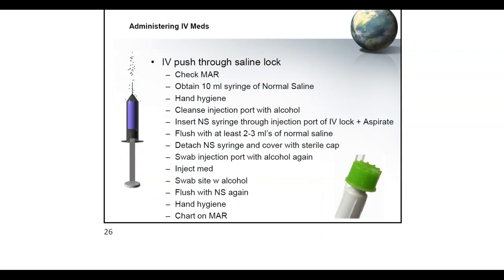All right, as I mentioned earlier, there are times that you don't have any continuous IV fluid going. So what you're gonna do is basically very similar, except you have to flush it. So if you don't have continuous IV, it's saline lock, so meaning it's locked with saline. So it's just cap. And the reason why we call it saline lock is because before you cap it, before you put this cap, you flush it. So every time you do something with IV, you flush it with saline and then you lock it with a cap. So it's saline locked.